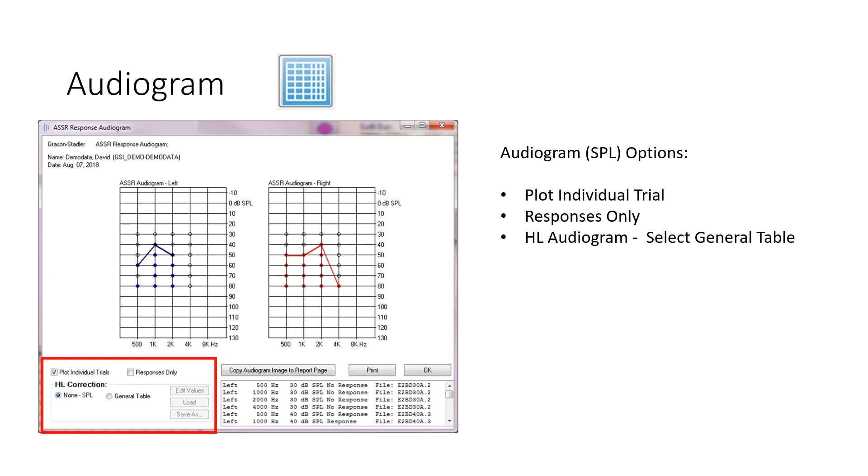So if we look at the right ear at 500 Hz, a response was obtained at 80, 70, 60, and 50, but not at 40. So we've plotted every one. So the other thing you can do, this is an SPL audiogram. If you want to look at the HL audiogram, so it's simply going to convert that, you would select the general table down there in the bottom under the HL correction.